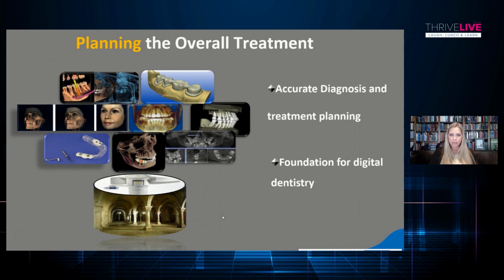And so, what that basically means to you in layman's terms is you can take your scan and put it into thousands of different types of software and do pretty much anything you want to under the sun. If you decide you really want to do a lot of 3D modeling, 3D printing, that sort of thing, you can definitely do that.